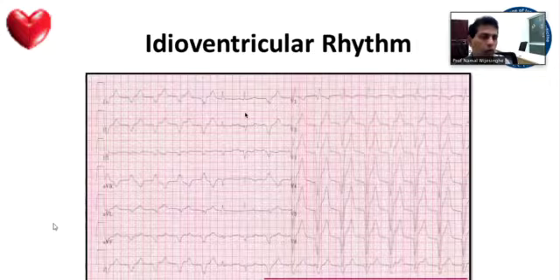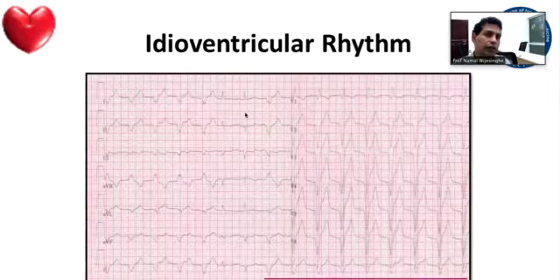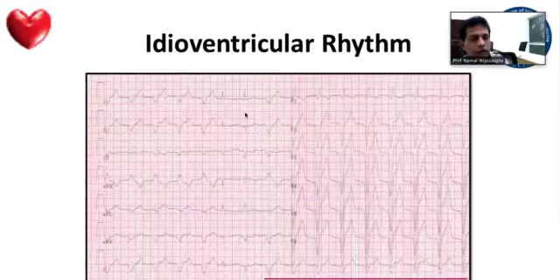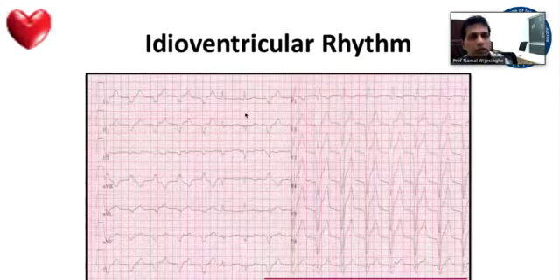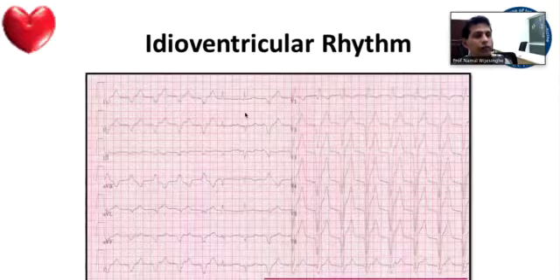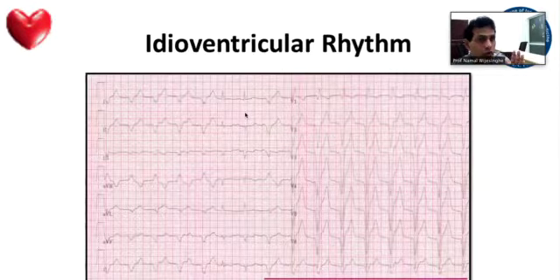and this is also, I want to tell you, this is not ventricular tachycardia. This is called idioventricular rhythm. Idioventricular rhythm is a wide complex rhythm. Usually the heart rate is within the normal range, or sometimes there is a rhythm called accelerated idioventricular rhythm where the heart rate is about 110 or 120. But you need to know what this rhythm is. This is not ventricular tachycardia.